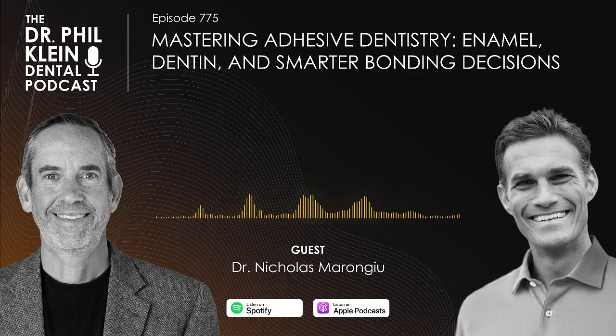You're exactly right. Yeah, the chemistry is different by which layer you're working with, and it's vital to follow the protocols on the particular resins that you're using so that the chemistry can interact appropriately. It's vitally important for these to be predictable and successful long term. Right. So just because there's a new generation of bonding systems, I don't know what generation we're up to now. 7th, 8th? I don't think anyone knows. Right, exactly. Well, I think we're past the 7th generation. But my point is some of the older generations and methodologies that we use still apply very much today, especially when we're talking about just enamel, the total etch technique, for example.